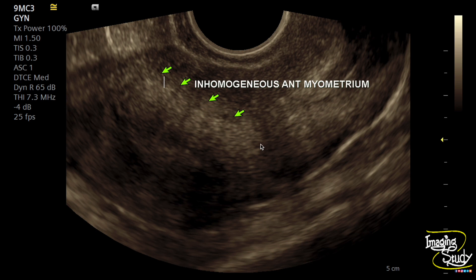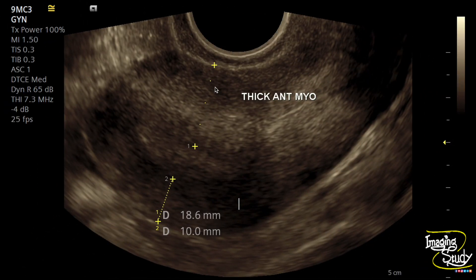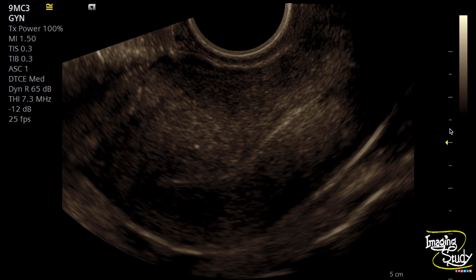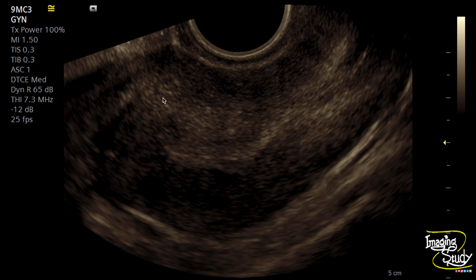Here is a magnified view and you can see the inhomogeneous antero-myometrium quite well, with tiny cystic spaces at the endomyometrial junction. The antero-myometrial thickness is more than the posterior myometrium. Another magnified image again confirms the antero-myometrium showing tiny cystic spaces at the junction between the endometrium and myometrium.